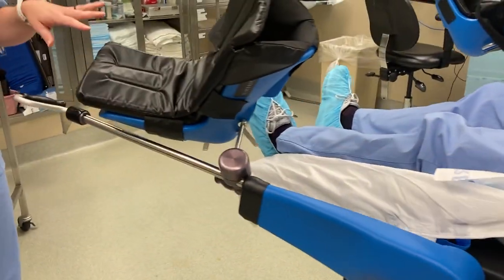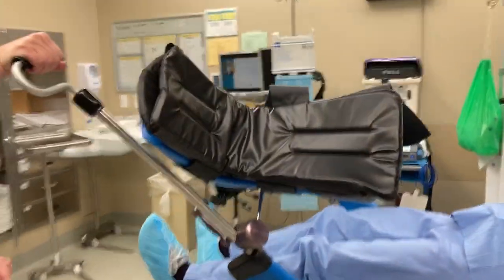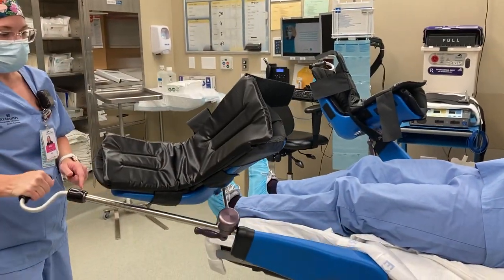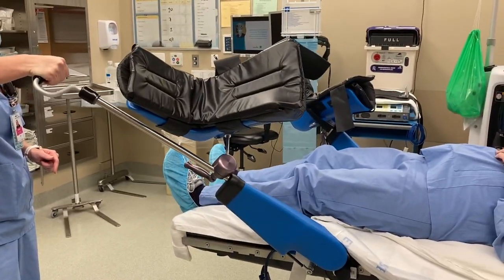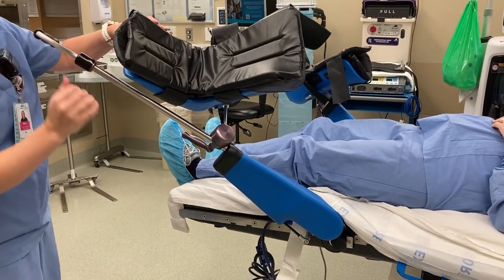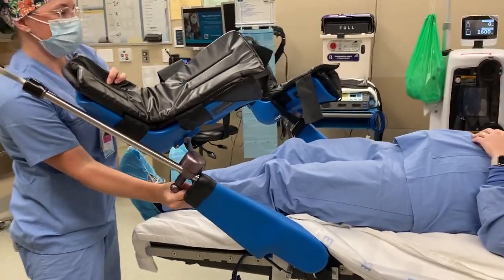And then to adjust the stirrups, you use these. You lift towards the ceiling to move it up and down or in and out. I'll make this one even with the other one. And then to move the boot, you adjust this just like the labor beds.